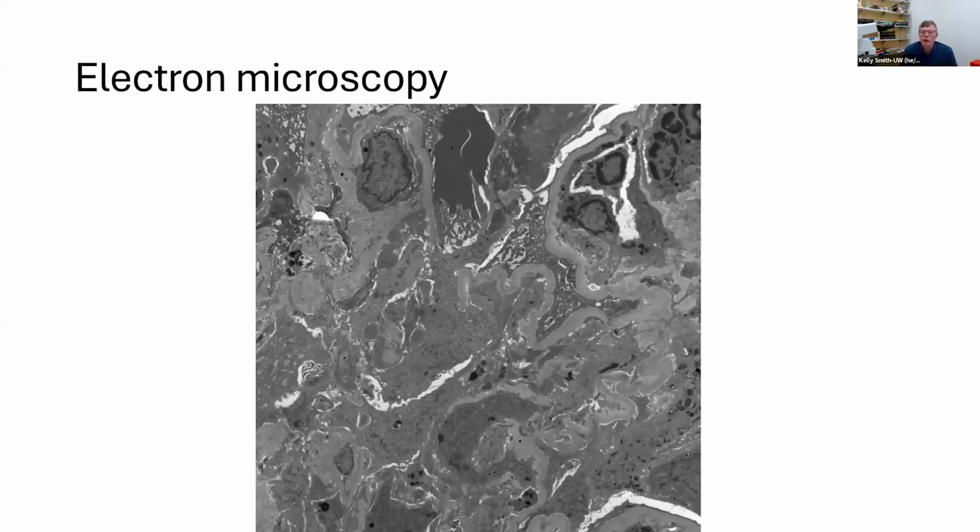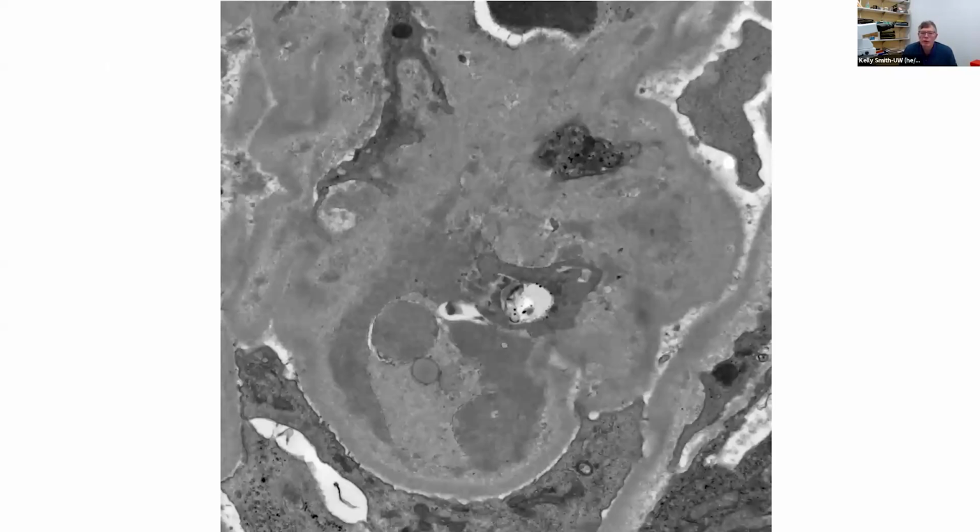Here's the glomerular basement membrane. Here's maybe some endothelial cells. This is possibly mesangial region. Here's some glomerular basement membrane. We have a break here, some sort of cell present along this break, another cell here. So it's really difficult to figure out what's in and what's out in a crescent like this.